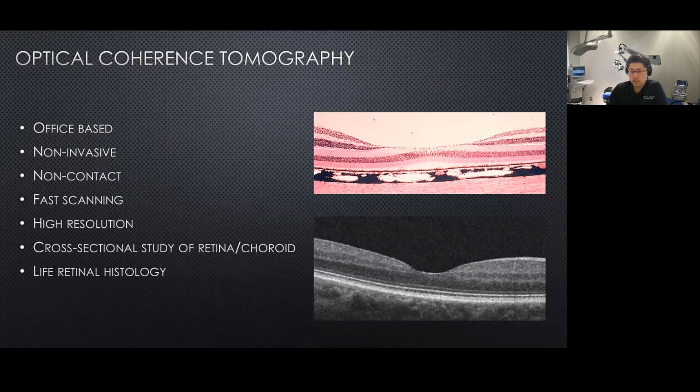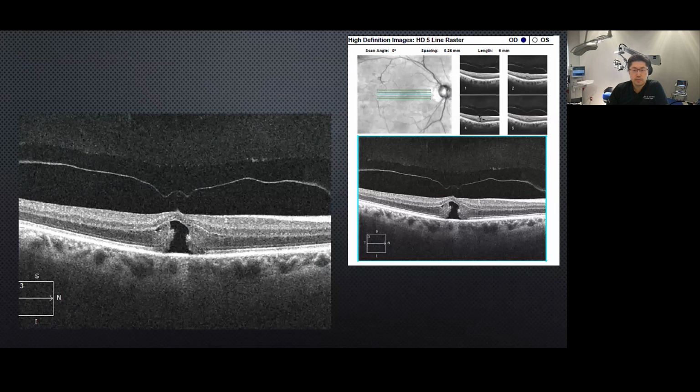We already are able to explore the choroid, with the advancement of enhanced depth OCT and also OCT angiography. I know a lot of people expressed interest in learning this, so I added a few slides on this to today's presentation.